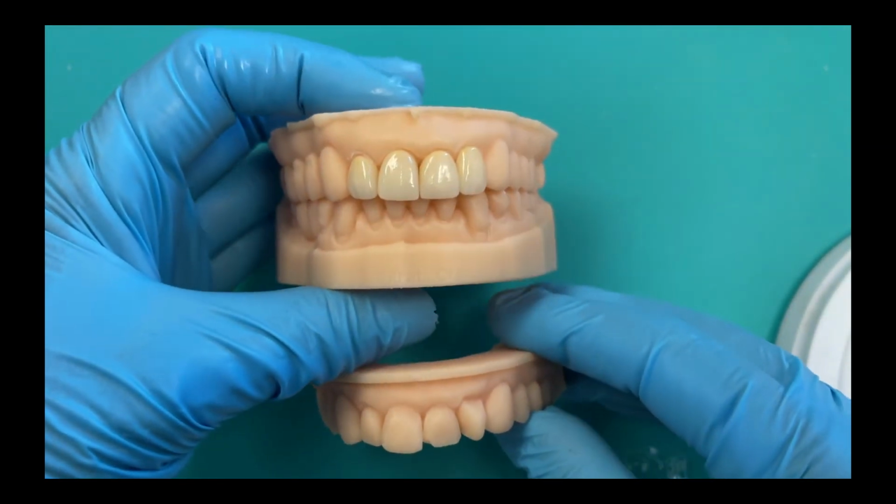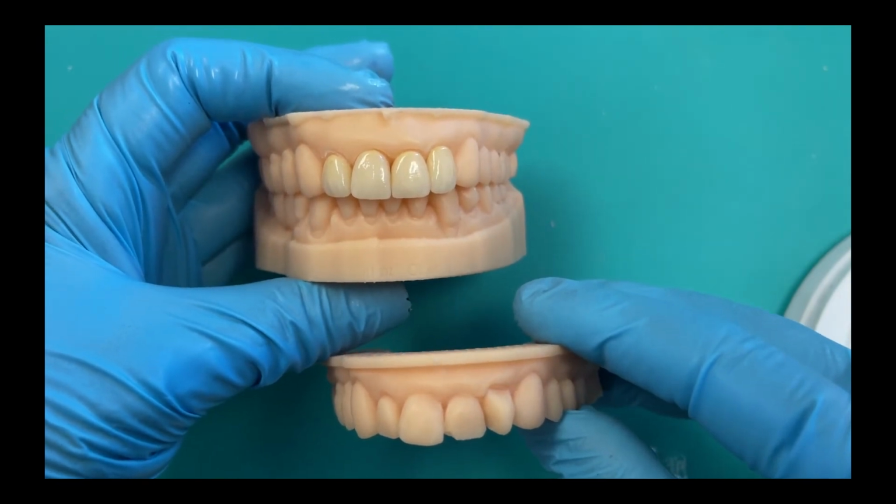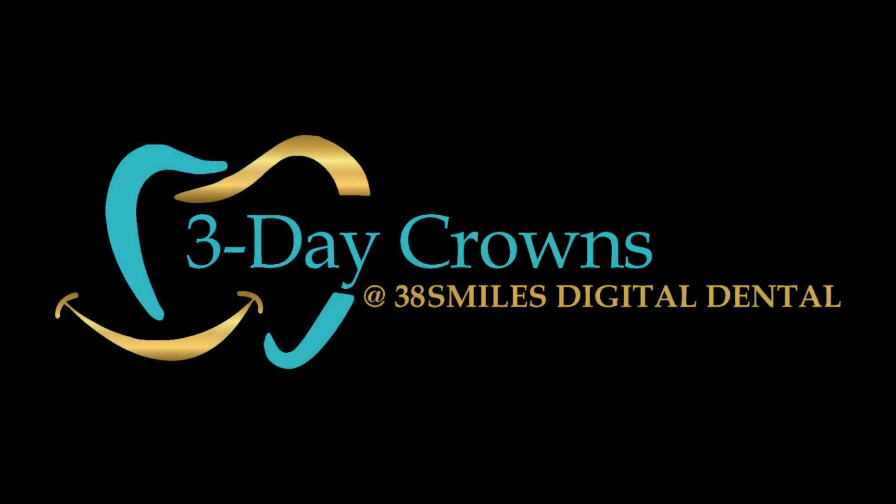So just to see again what the before looked like, we pop off the stent here, and you get an opportunity to see what a big difference that is for the patient going from the before to that after. And of course, you have a much higher chance of case acceptance if the patient is actually able to see this aesthetic result in their mouth before they start treatment.